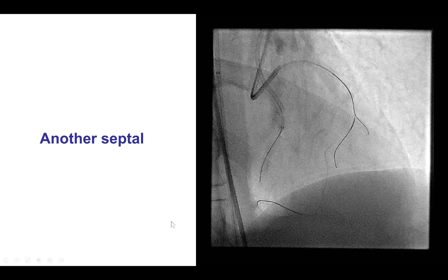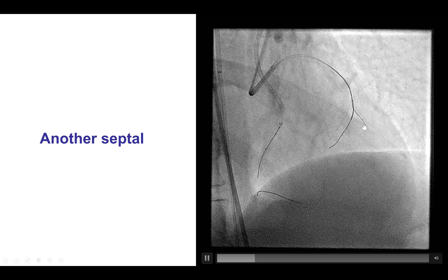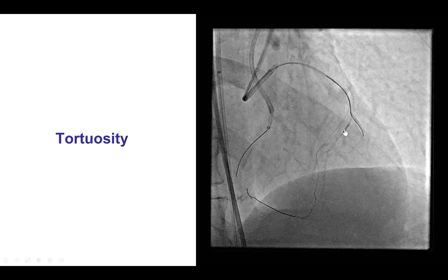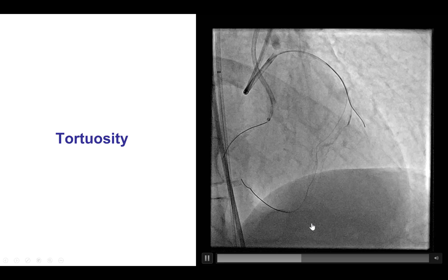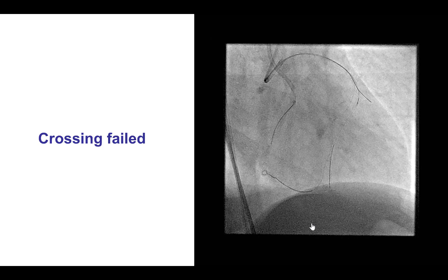After multiple failed attempts, we decided to try to cross through another septal — the third septal. The wire went through, but it was very challenging. Surfing failed. An injection demonstrated significant tortuosity, and it appeared that septal may enter the same area of the PDA as the previous septal. So we eventually decided to abandon this and try a more distal septal collateral.